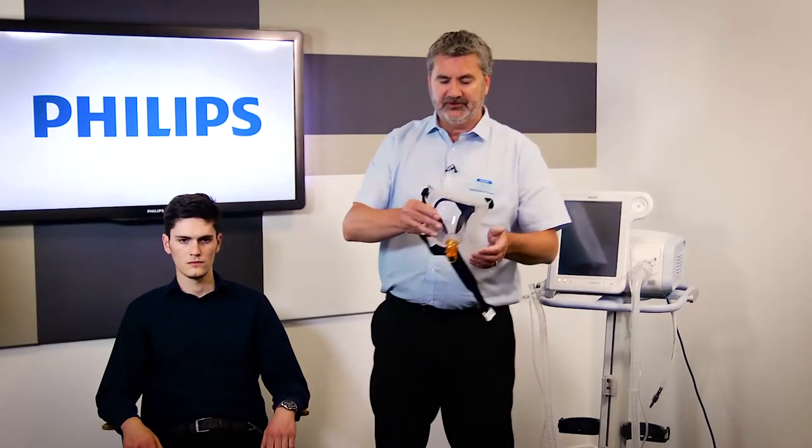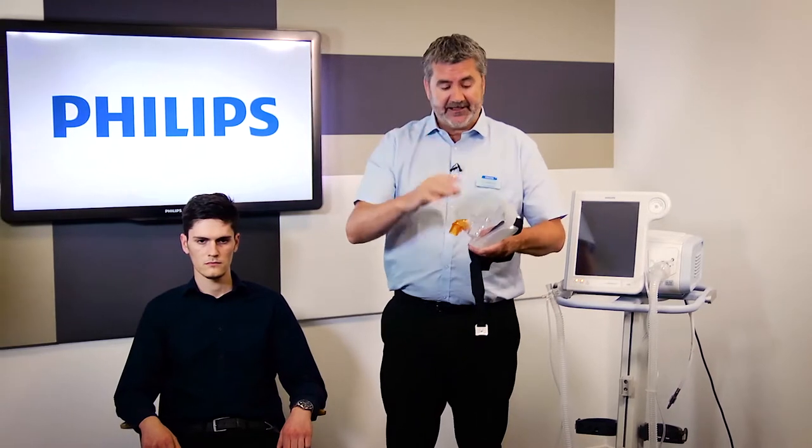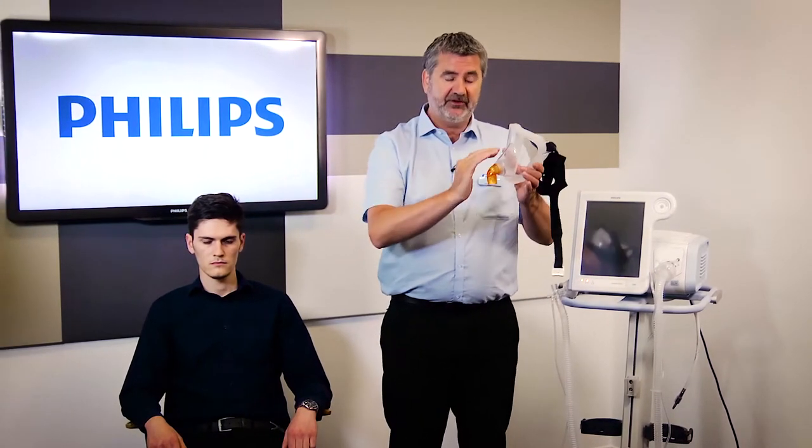Starting with the Performax, which covers the full face, and it's very important to measure. There's a measuring gauge on the bag that simply goes around the top of their face and below the lip. Never put a mask underneath their chin because, as we'll see with the AF-531, if they move their mouth up and down it does tend to rub on the bridge of the nose. The Performax is good because it goes over the nose, so you simply can't get any pressure sores.